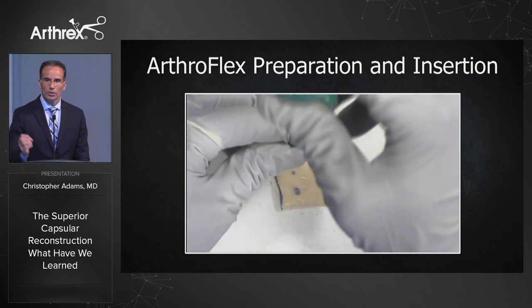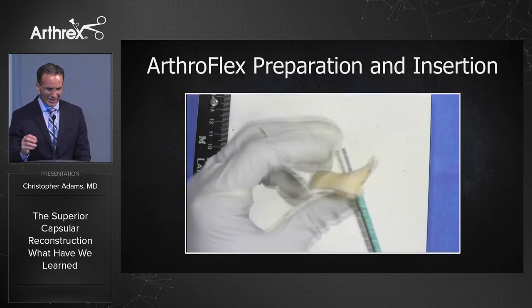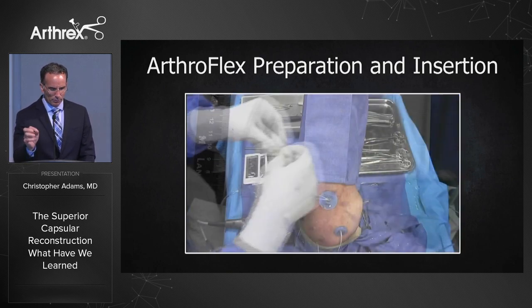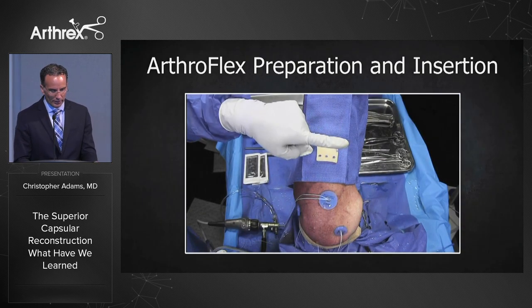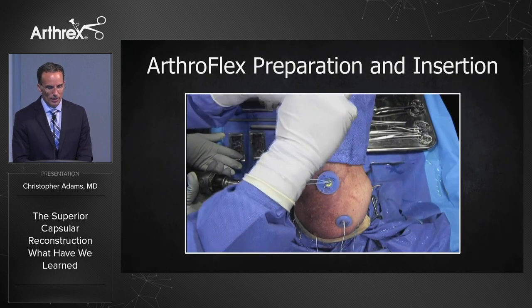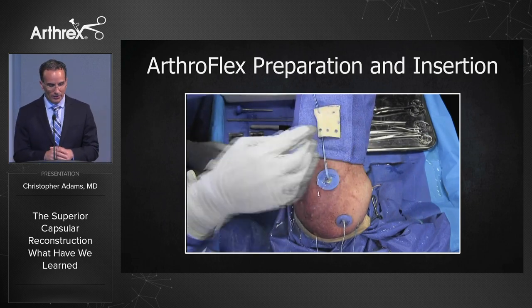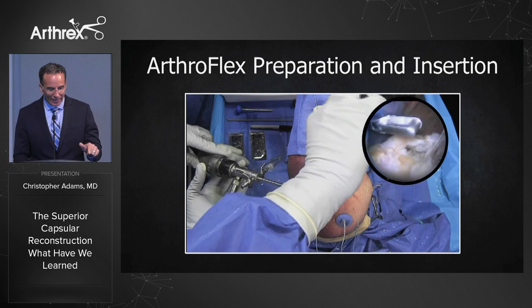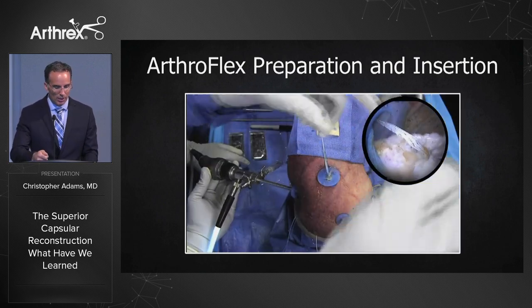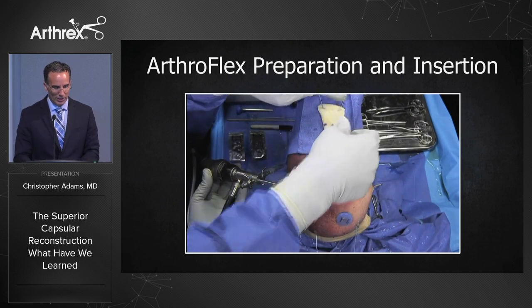Where the fiber tapes are going to slide through, take that swivel lock driver — that's where you can make it easier so the tapes slide nice and easy, just put two little poke holes. An important pearl: have your assistant really pull tension on those sutures, really crank on them, to make sure that when you grab the sutures you don't tangle them up. Have them really pull tension while you're doing this.